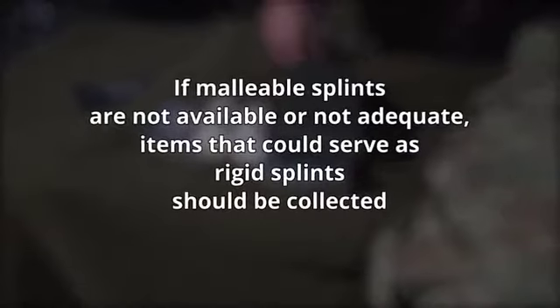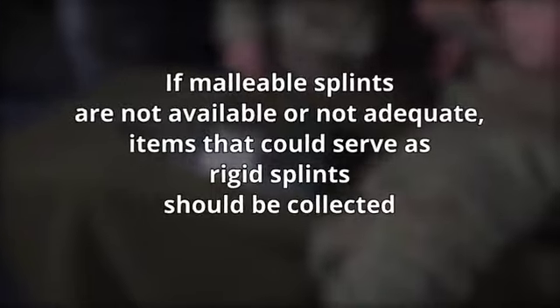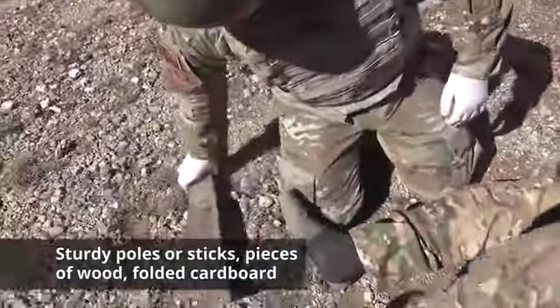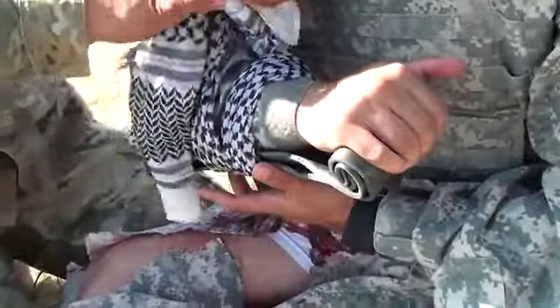And if malleable splints are not available or not adequate, items that could serve as rigid splints should be collected. For example, sturdy poles or sticks, pieces of wood, or folded cardboard. Padding materials can be made from extra cloth or even some types of packing materials.